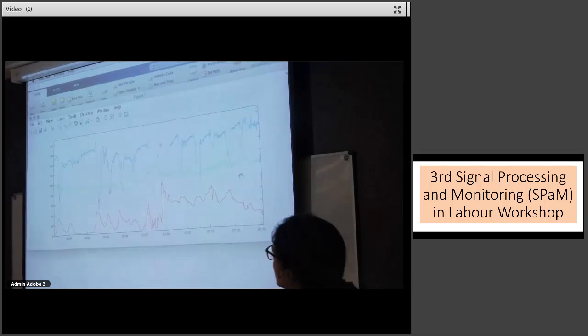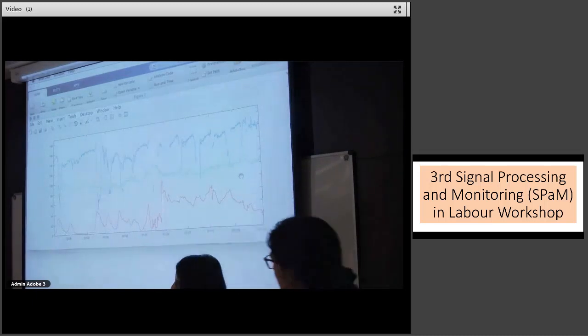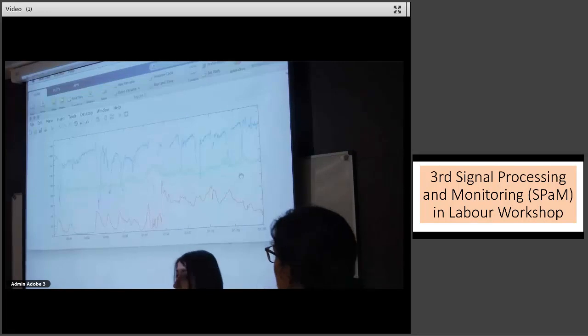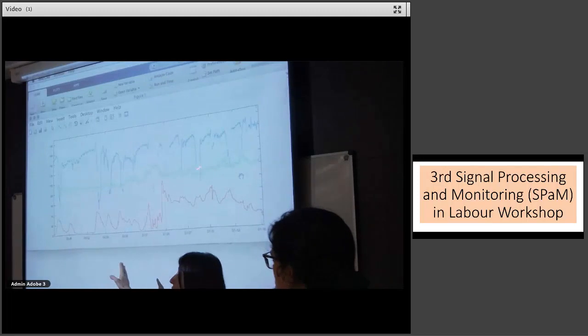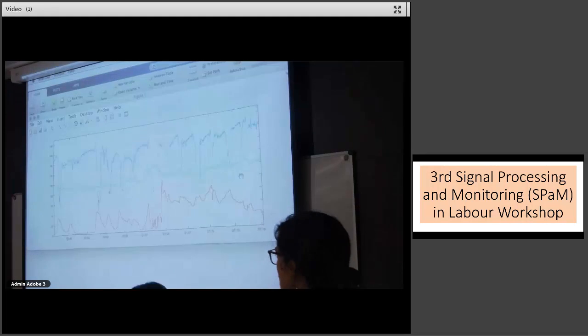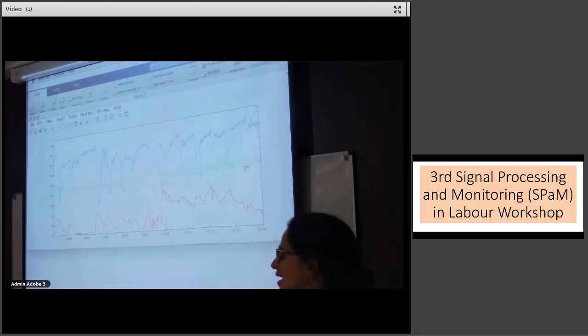But do we all agree that in terms of software as an early warning system, you want your software to be raising an alert here, so that the consultant can review, so that the doctor can be making the decision? Absolutely. Sometimes that's when the alert should have been, when you need to stop oxytocin. And sometimes we have very busy labor wards. People are doing many things at the time, and if there is an alert system, maybe people will just stop what they're doing and evaluate the tracing and take measures.